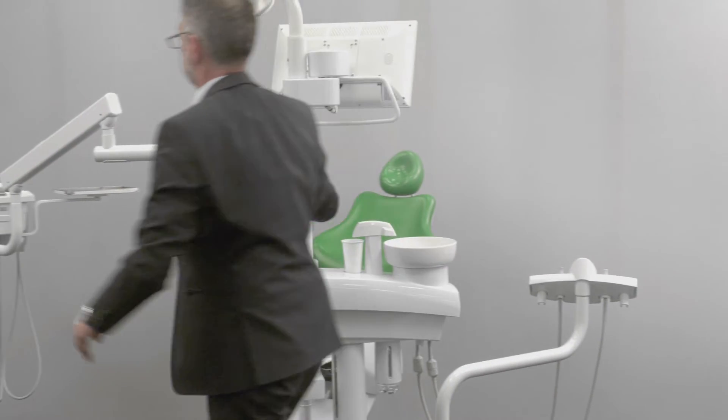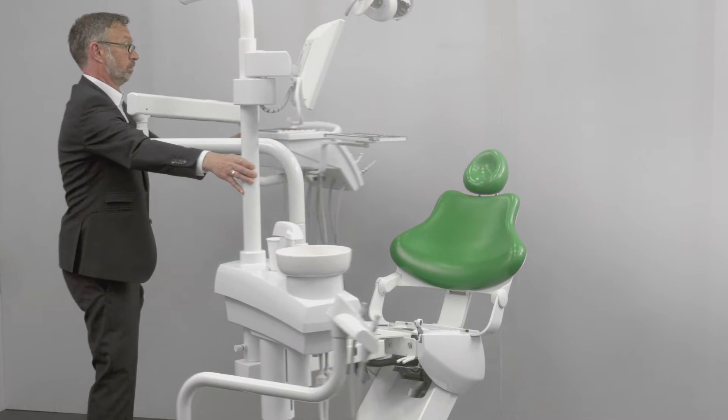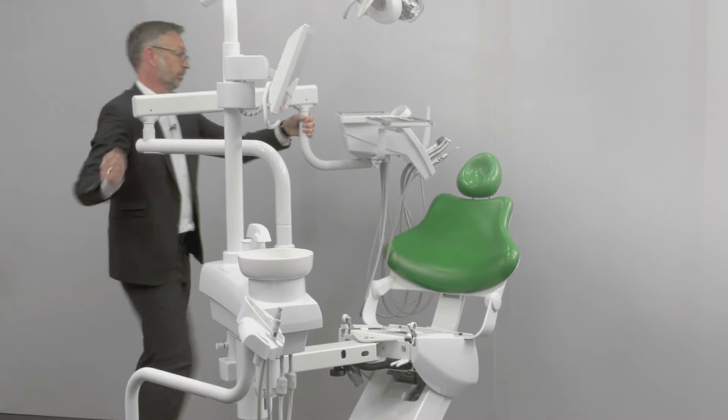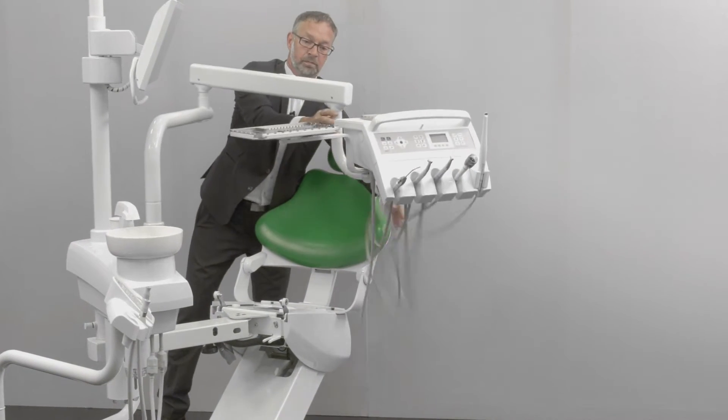Swivel the patient part with the dentist and assistant element to the other side of the chair. Please make sure that when swiveling the dentist element and turning the unit itself, the instrument tubes do not get caught on anything.